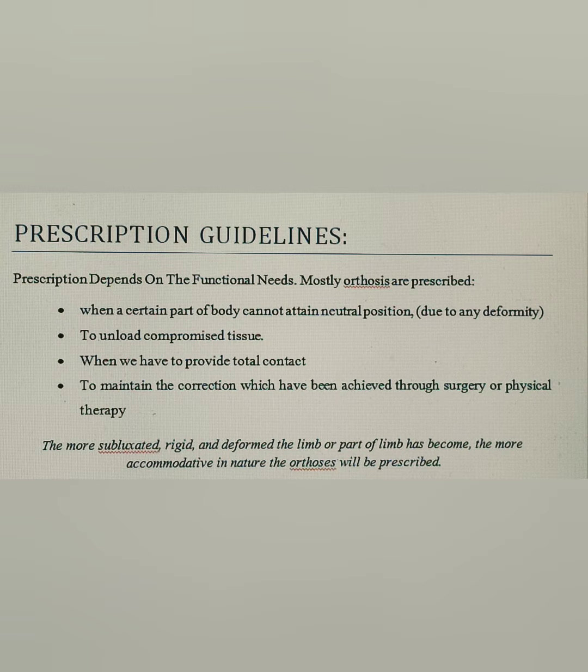We must remember one thing, that the more subluxated, rigid and deformed the limb or part of the body has become, the more accommodative in nature the orthosis will be prescribed.